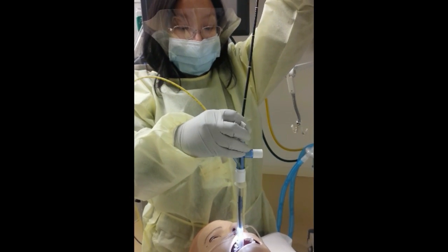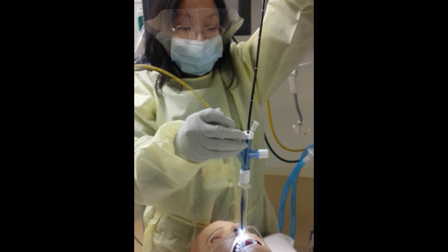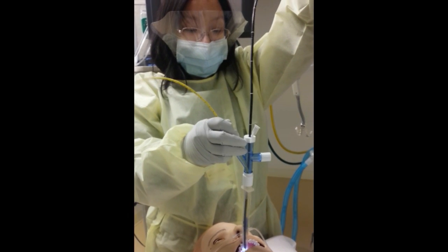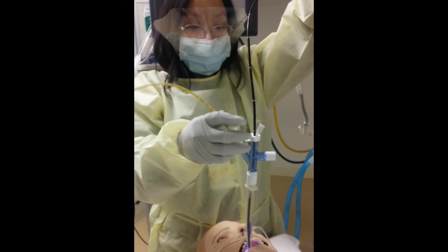Next, advance the scope and blocker together to the desired area. You may need someone to help advance the blocker at the same time as the scope.